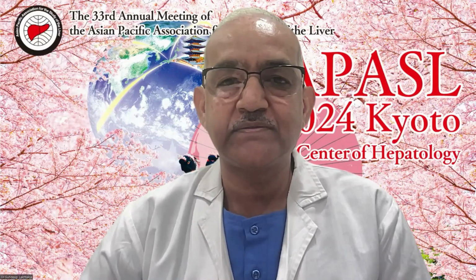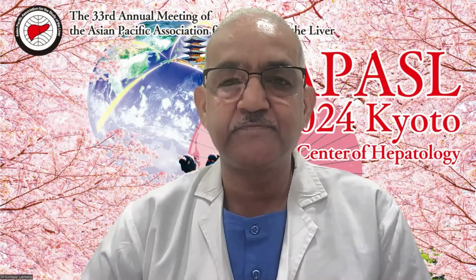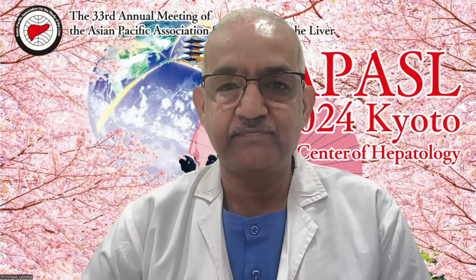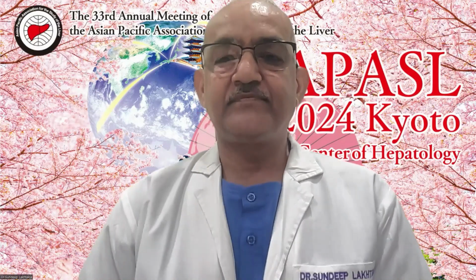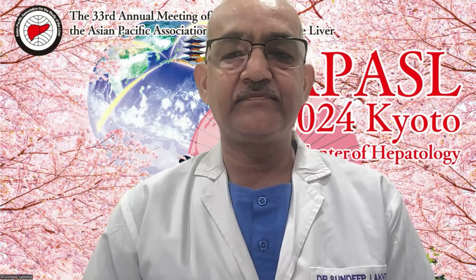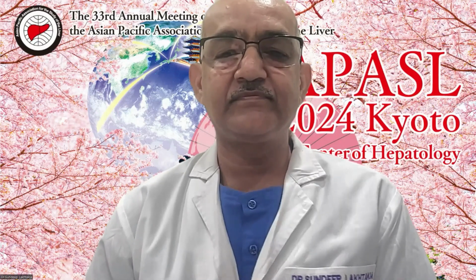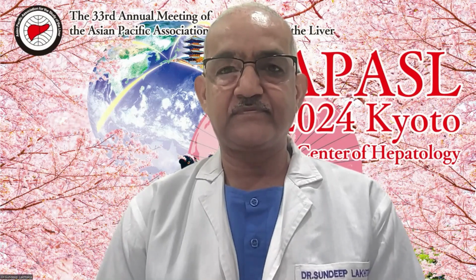But now with EUS-guided vascular treatment, I think we can inject more and obliterate more because we have coil, for which the incidence of emboli is very low. So do you think that with EUS-guided coil placement plus glue placement, they will reduce the chance of the patient going for BRTO?